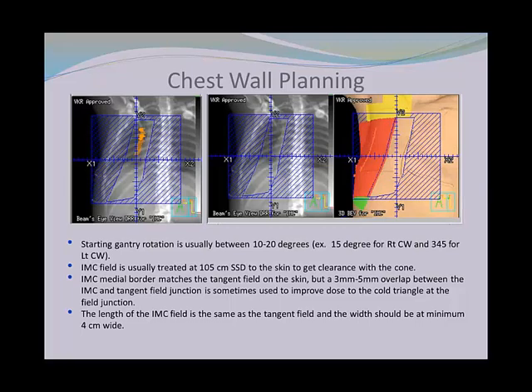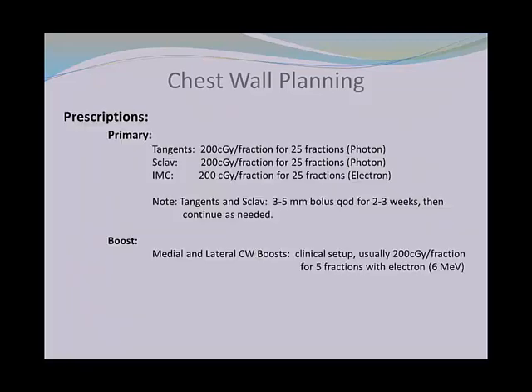Typically we don't replan the supraclav field. We just use the same supraclav field as before, and we make sure that the therapist puts the bolus on that day. For the tangent fields, we basically take the tangent plans, create another plan with a bolus, and then recalculate that plan with the bolus to get the new monitor units.